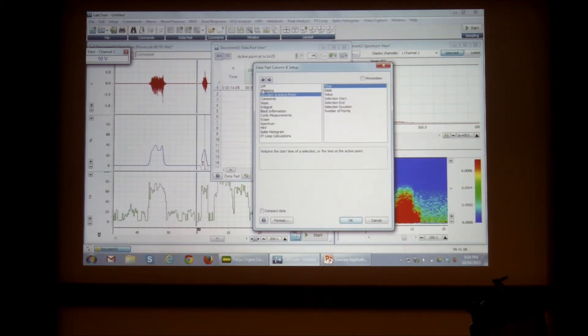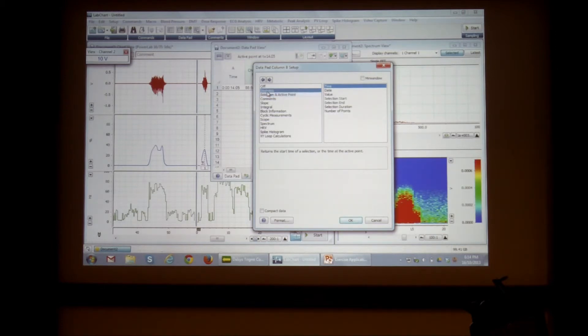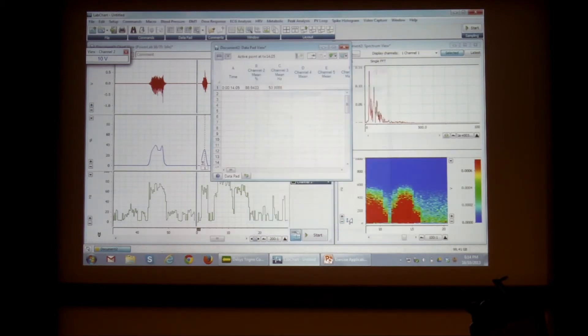So here, statistics, I can calculate a mean.